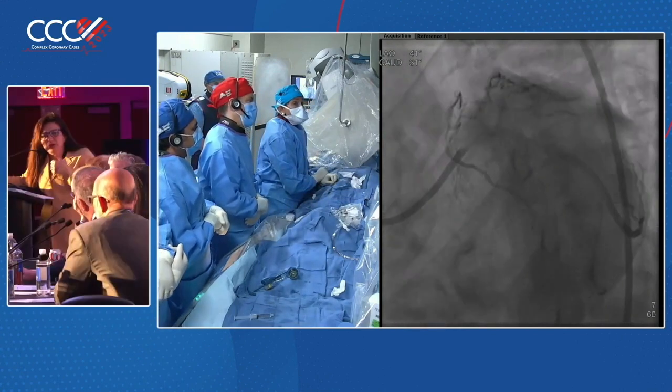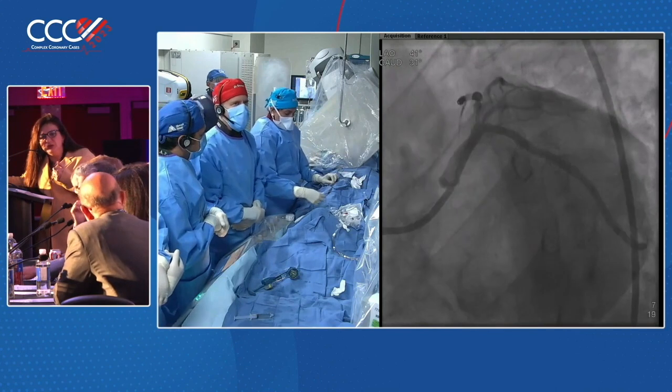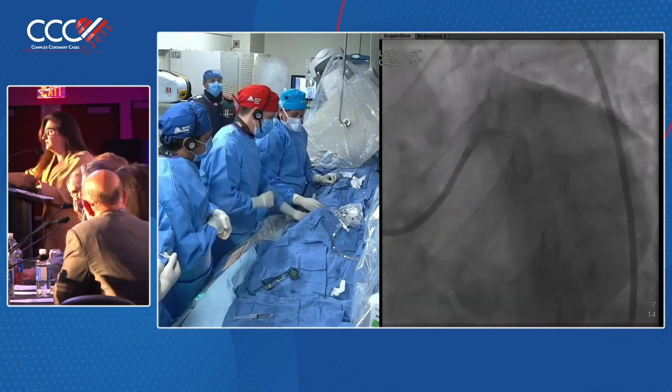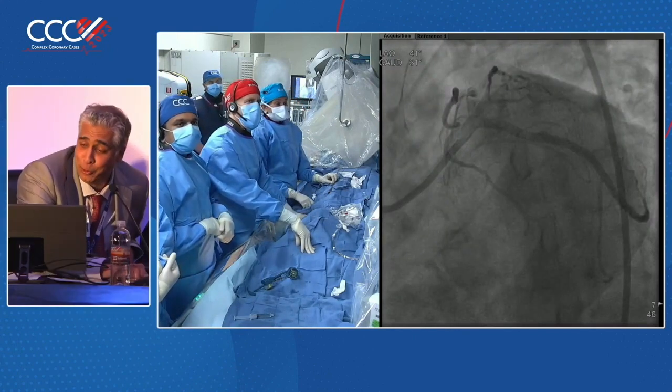So absolutely imaging. Would anyone do this without imaging? Nitin, I don't know how much imaging you're using, but I'm told maybe not as much as we all would like you to. Well, it's a lot more than 2 years ago.